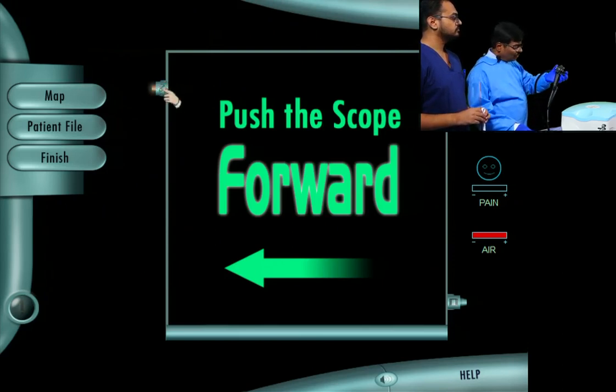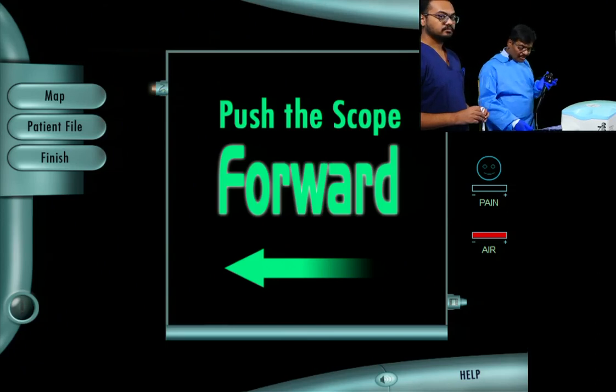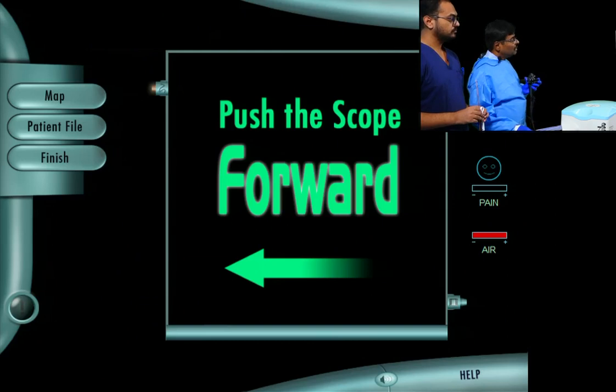Right now, I have a joystick, which is something like a pediatric colonoscope, in my hand. I am holding the control head in my non-dominant left hand, and I have the insertion section, as you can see, in my right hand.